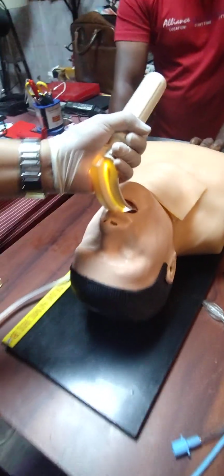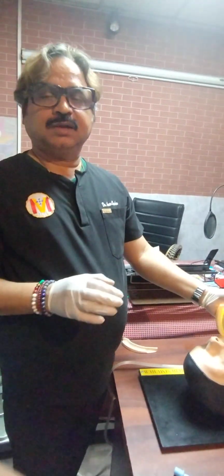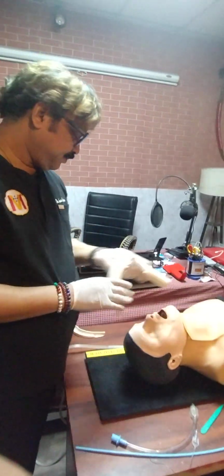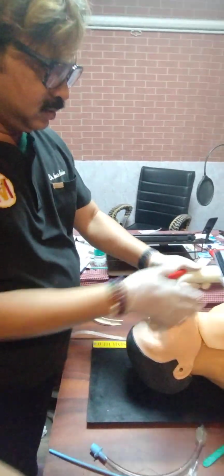Okay, now the idea here is that we have devised our VERVE straight blade laryngoscope. It's a rescue video laryngoscope. So I want to use that, and I'll try to intubate this patient with the VL. So this is our VL. I think I have already explained the features.